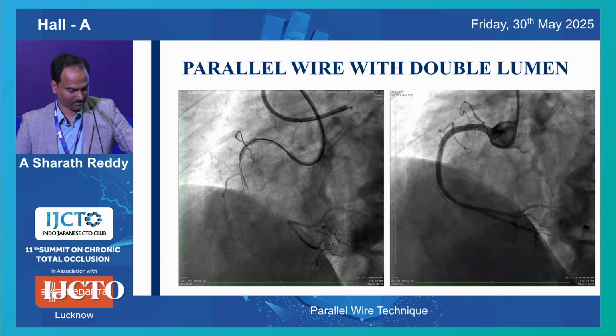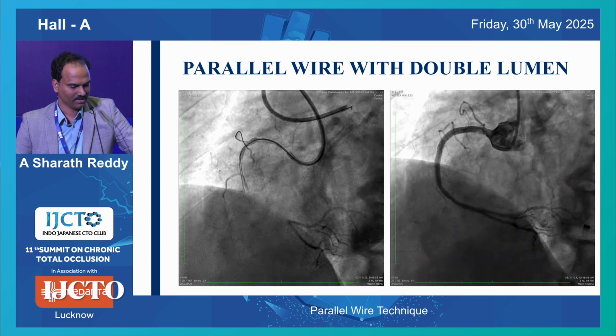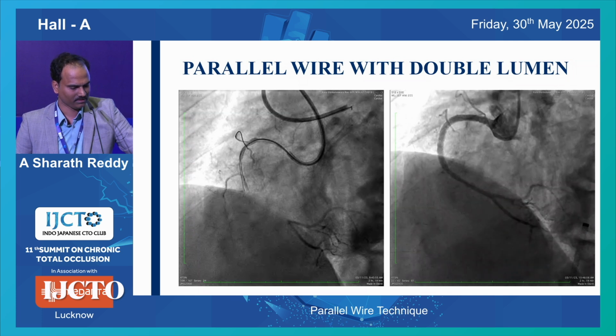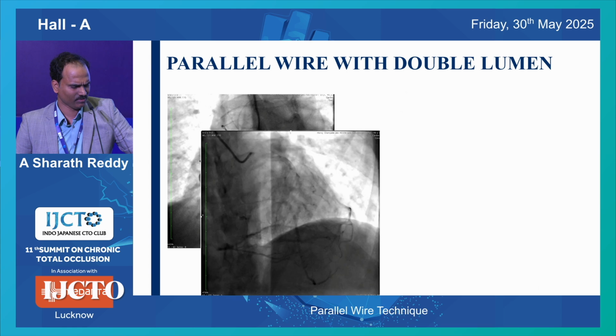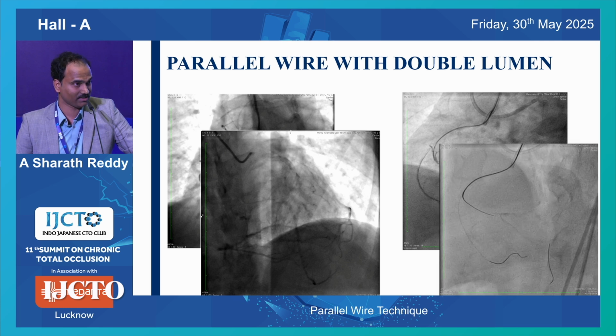And you will achieve a good result without losing any side branches when you enter the very proximal part of the distal lumen. And you can see another case, a distal RCA CTO, where there is a good vessel even proximal to the PDA origin. We tried Fielder XTR, it didn't progress, so I had to escalate to Gaia 2.